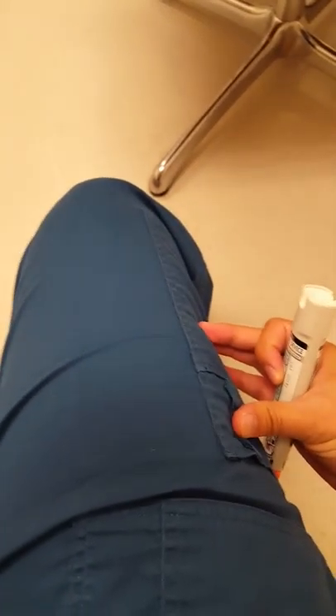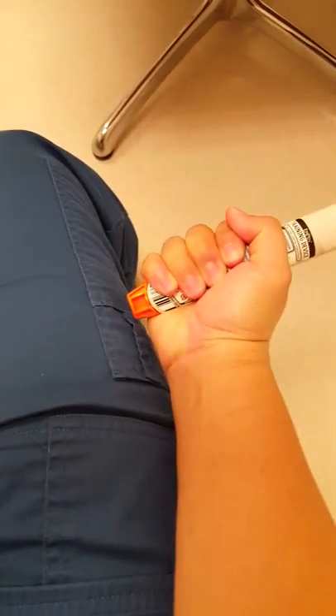If you divide it into thirds going across, you want to look at the outer third of your thigh — the middle third will be here. Essentially, the length of your arm, if you're making a fist, is exactly where you want to inject it.